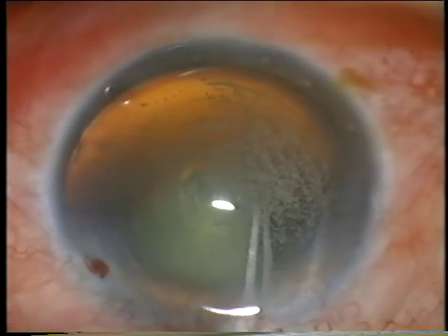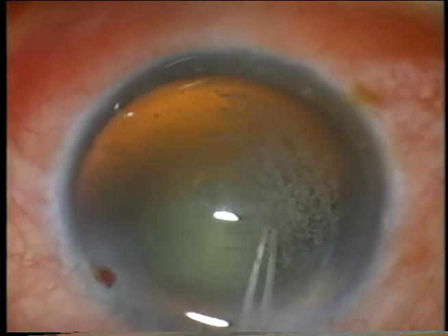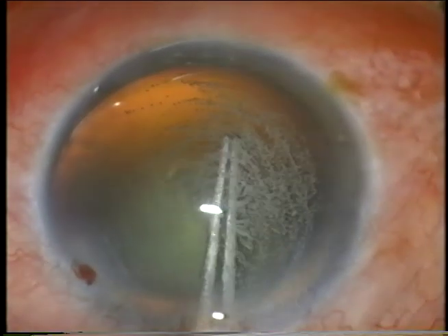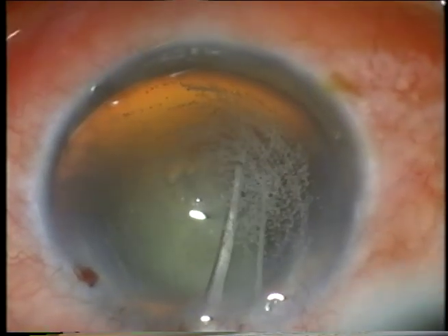I'm doing a capsulorrhexis here under Viscoat, re-grasping as necessary to keep control of the tear.